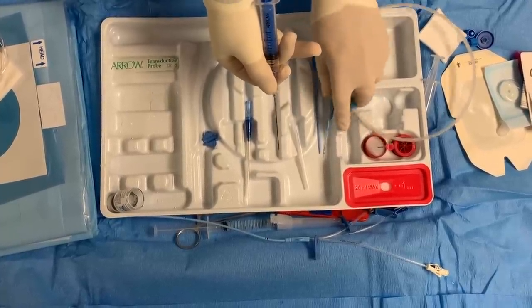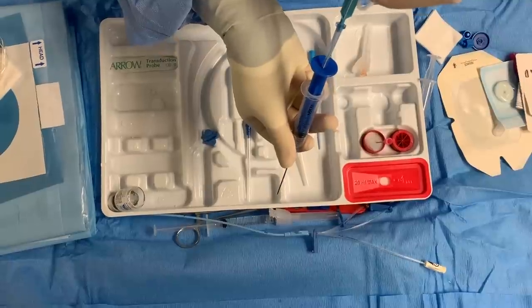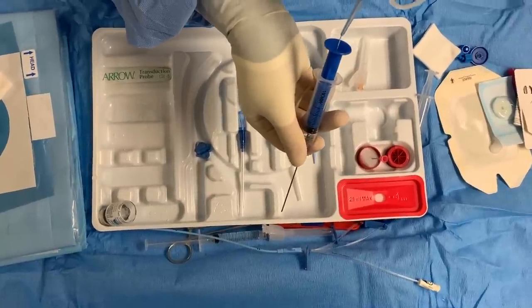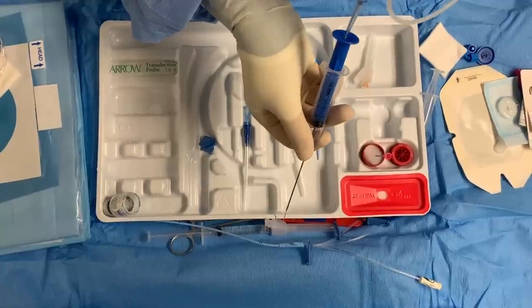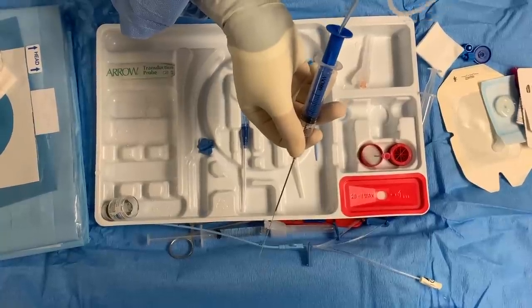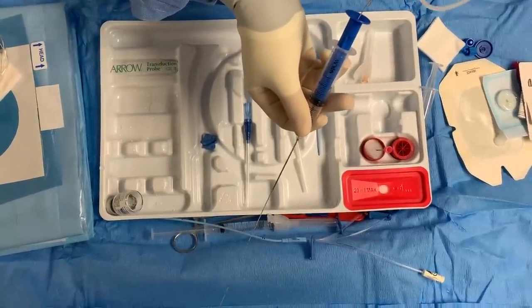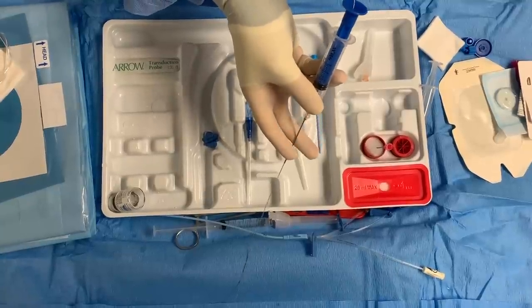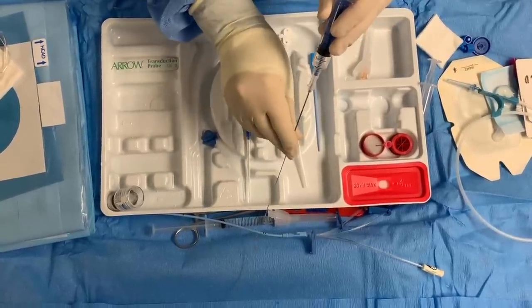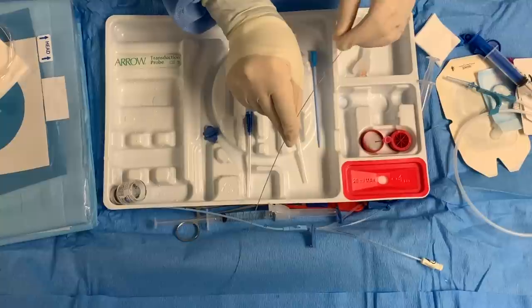Once I see blood, I hold it steady. Then with my other hand, I will put in my guide wire. The guide wire goes in through the top like this and you guide it in. It's going to go through your needle into the vessel. You go all the way — keep going all the way. Until you see the tip, you'll see the tip to about here. Now you pull back. Then you hold the vessel and pull your needle out — but you have to be very steady, keeping the wire in the vessel.